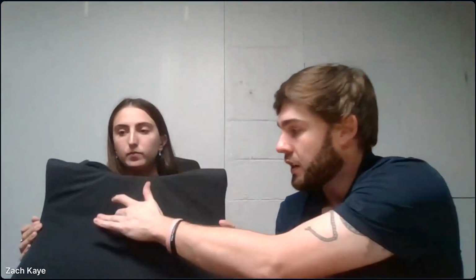So for this cushion, there's 2 air bladders in the front for the thighs, and then 4 along the back for the seating surface. So there's 1 under each of the ITs, so they're anatomically placed based on the size of the cushion. And then there's 2 air bladders on each of those lateral pelvic supports. So if you're trying to suspend and float the ITs, you can build up the lateral pelvic supports and float those ITs to offload them really well for any existing pressure injuries.